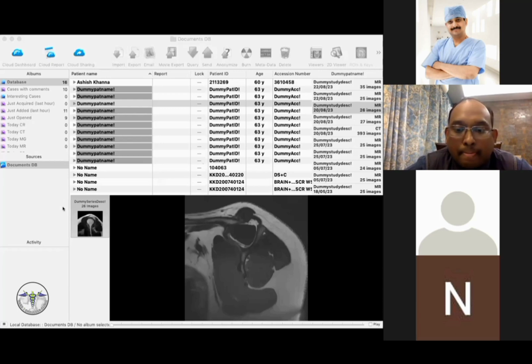Sir, can I ask a question now? Yeah, please. Sir, first we took the whole diameter according to the best fit circle method, that was 2.7. And we subtracted small d, that is the glenoid bone loss. Correct. The remaining diameter, we took 83% of that. So we are not taking 83% of the whole capital D that comes from the best fit circle minus the bone loss. That is not what we do, sir. First we subtracted, and we took 83% of the resulting diameter. Now sir, we will not subtract again from that, right?